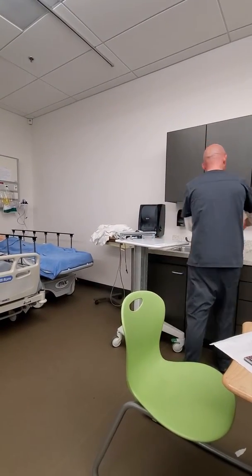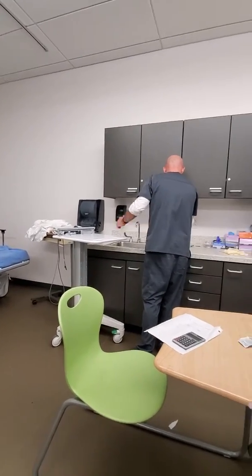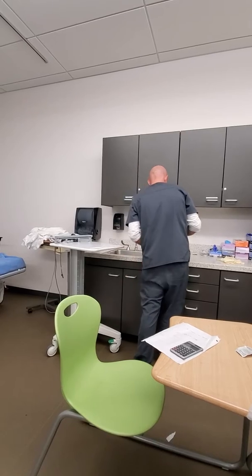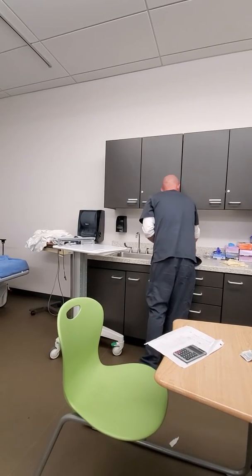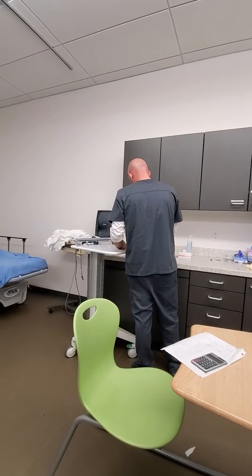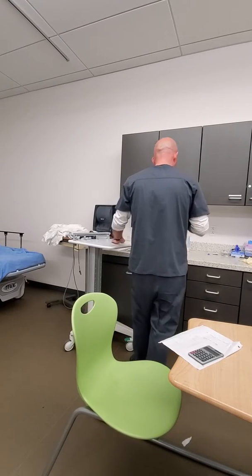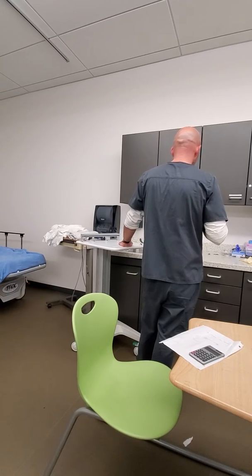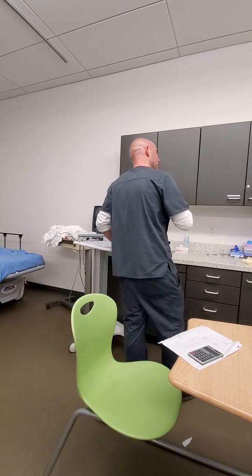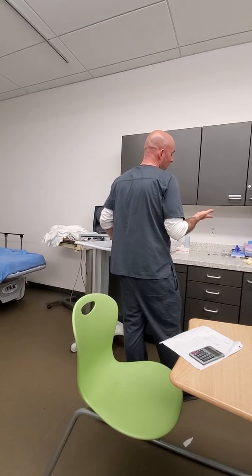So I open the door, I come into the bedroom, I'm going to hand sanitize, and I'm going to gather my supplies. Because this is a heparin lock, I need 2 syringes. Oh, never mind. I have my medicine and I just forgot the name of the other item. Do you need 2 syringes now? No, but I like to have extra in case something happens that I don't foresee. But I'll need one prior to administration of the drug and afterwards for the port that I'm going to be connecting this to, so it doesn't hurt to have it.